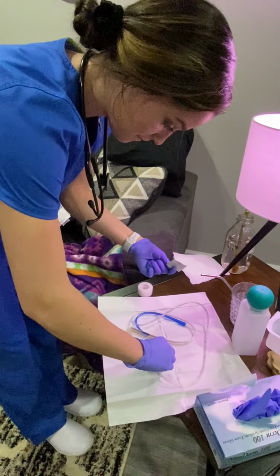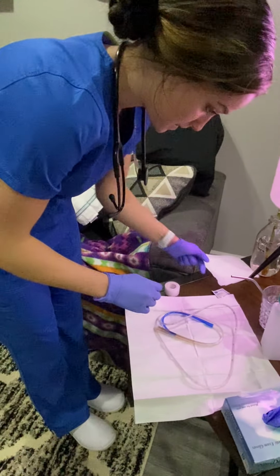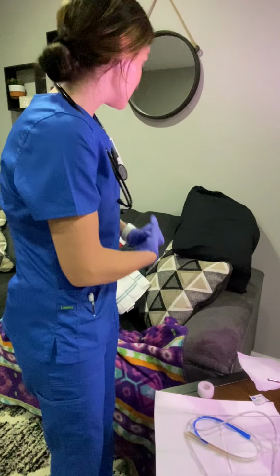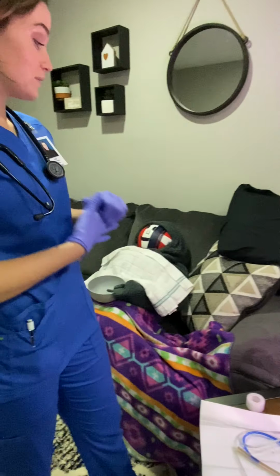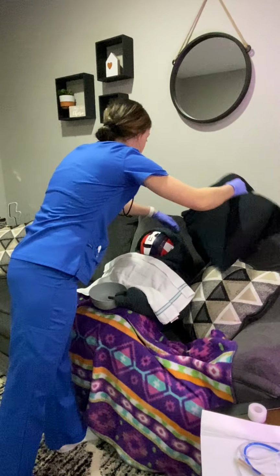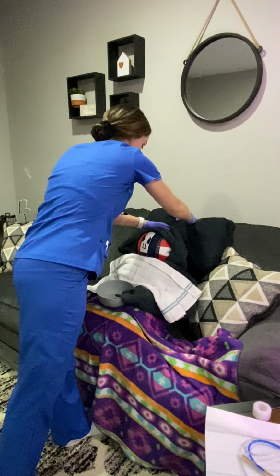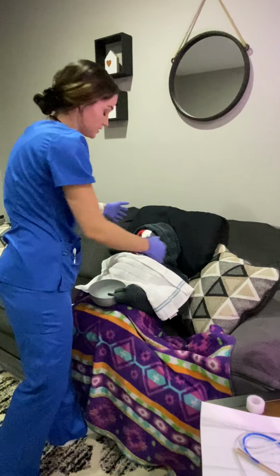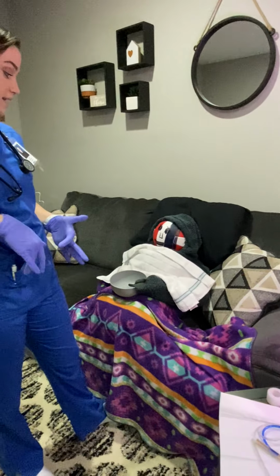Then, just for safety, I would perform hand hygiene again and put on clean gloves. Once my patient is ready and understands the procedure, I can put a pillow behind her head to have her up. I would have the patient in a semi-Fowler's position and ready for that.